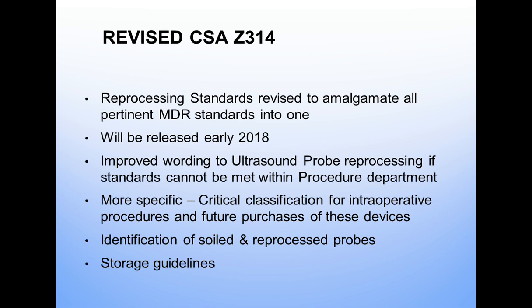So a little bit of news that's hot off the press: some of you may be aware, some of you may not, but the Canadian Standards Association has been working for the last 2 years to revise the CSA Z314 series of standards. So there are about 9 standards that provide information and guidelines on reprocessing.